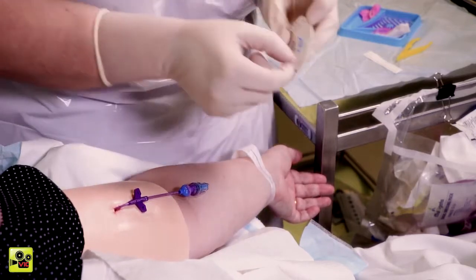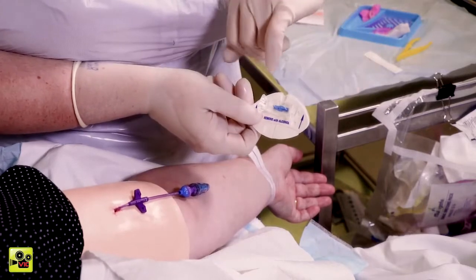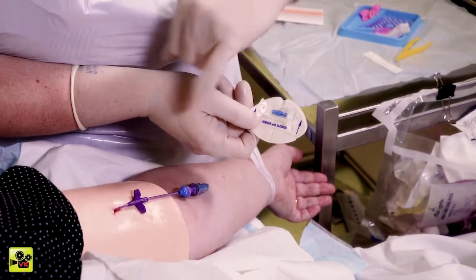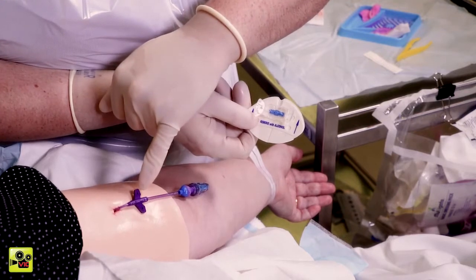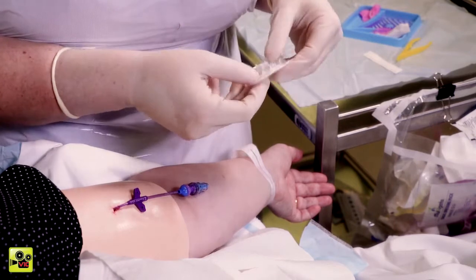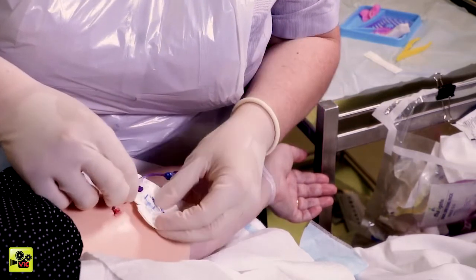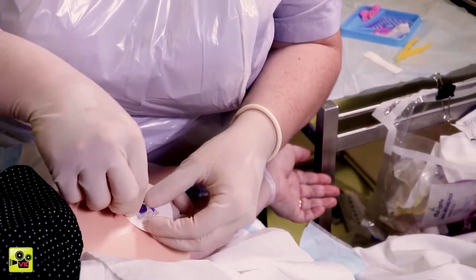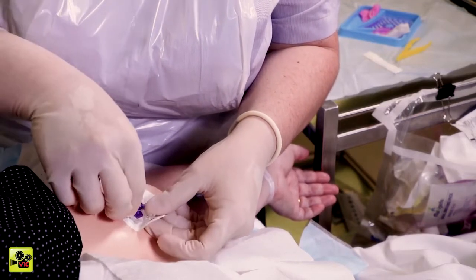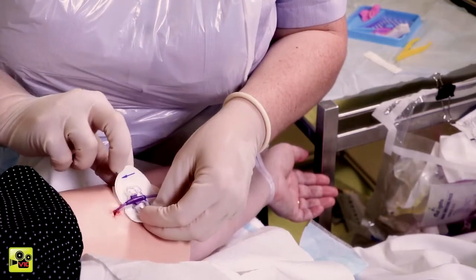Have you seen the StatLock before? Oh no, I've never seen one like that before. So these two little prongs, they go in right there. And that's what holds it to your skin and stops it from falling out if you were running around. Is that okay? All good.